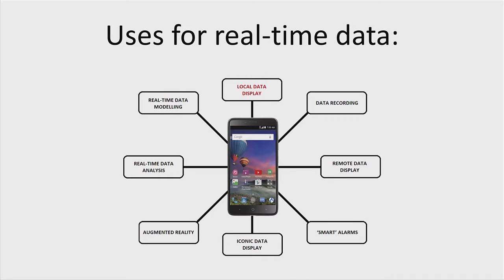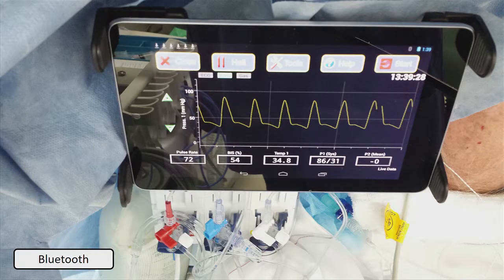The first thing we can do is clearly display the data locally on the phone. I've clamped a mobile phone just above the pressure transducers — the patient's head is here, this is the mobile phone, and there are the pressure transducers. The phone is receiving data via Bluetooth from the monitor behind me. The reality of mobile phones is that the user interface space is quite small, and when you plug in lots of waveforms it gets confusing. In this application, I allow the user to swipe between the waveform variables.